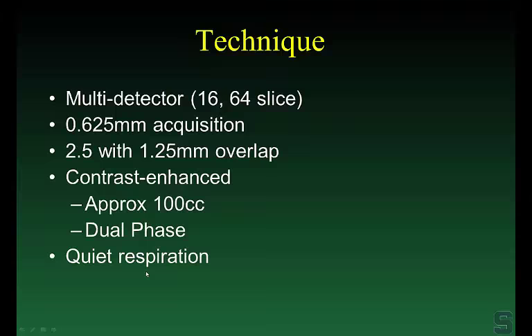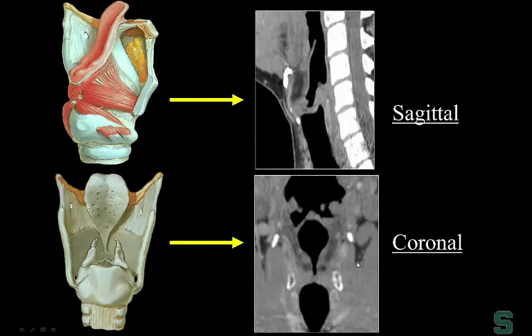Now we just do quiet respiration. One of the reasons to do the thin-section imaging was to get these reformats. On the sagittal view, you get a very nice view of the free margin of the epiglottis, the hyoid bone, the pre-epiglottic space, and the true vocal cords. On coronal images, here's the free margin of the epiglottis, the false vocal cord, the laryngeal ventricle, and then the true vocal cord. These detailed reformats can only be acquired with thin-section imaging.